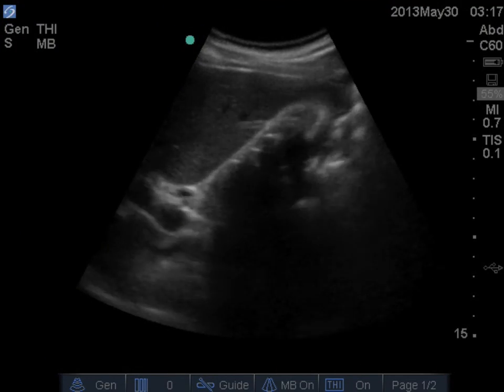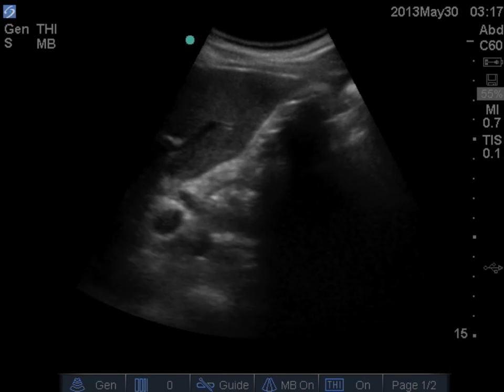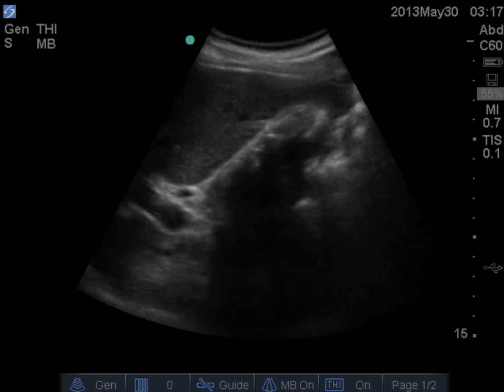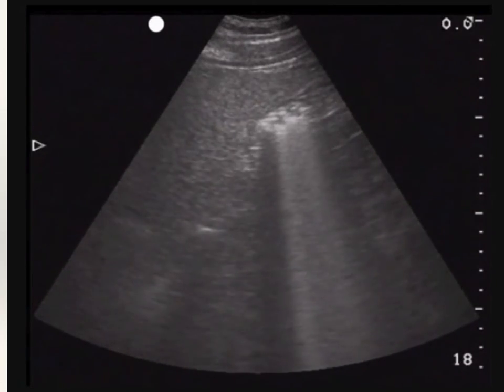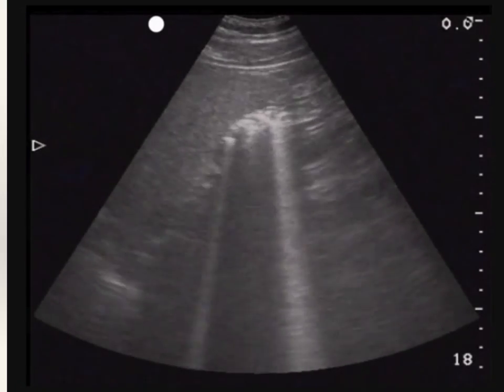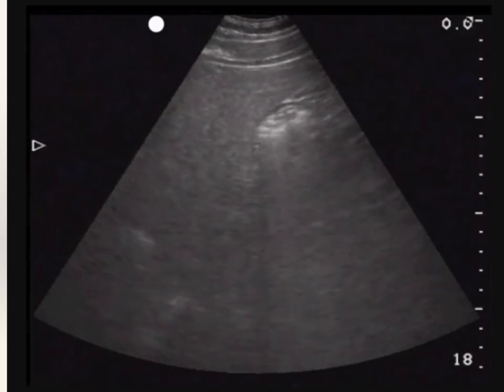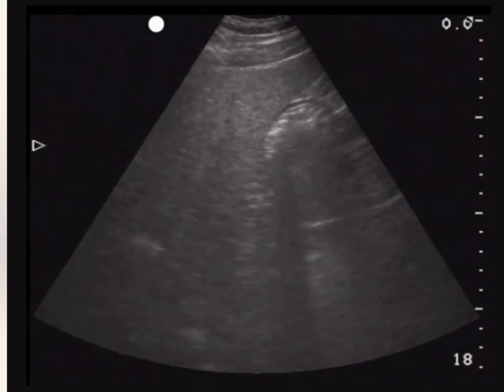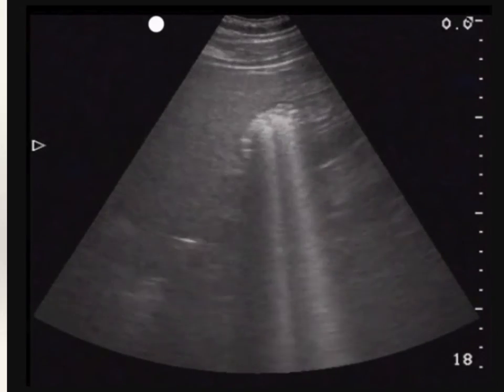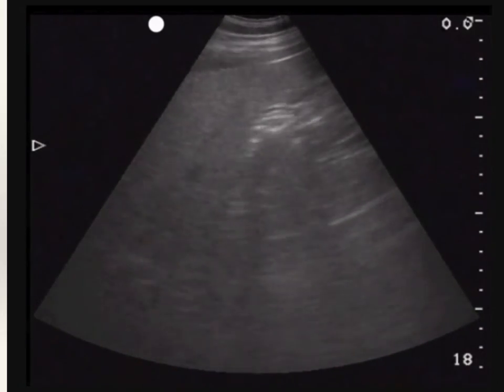This is another image showing much the same thing. Now, it's not just going to be that straightforward. Of course, there's going to be something that we confuse with this, and it's shown right here. Is it a wall echo shadow sign? Well, the fact that I said it's confusing probably tells you that it's not going to be it. It is something that's behind the liver, and it's sending off shadows from just behind its anterior wall. However, upon closer inspection, this is the duodenum.